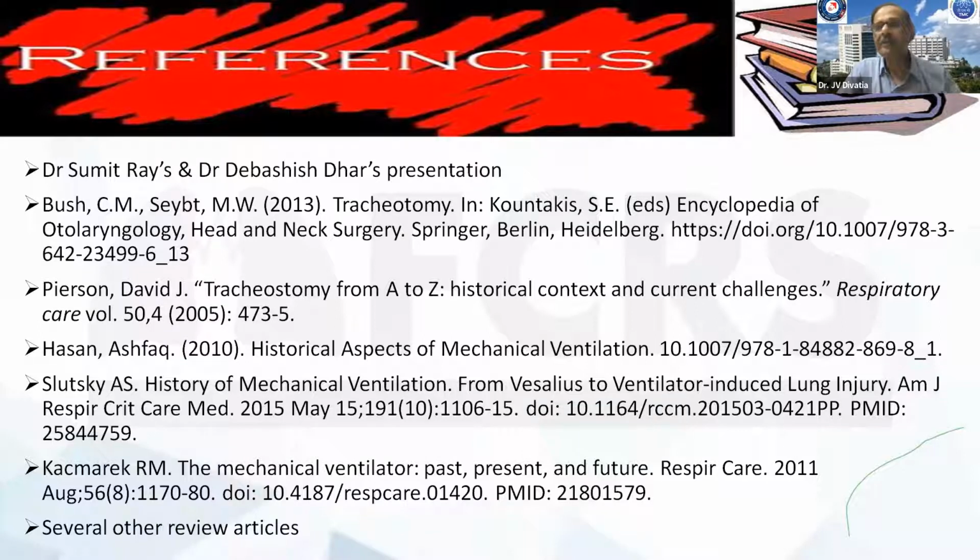development, or the history of the development, of the technology of ventilation, and at the same time the development of the biology of ventilation. I think the first few decades may have been spent in developing the technology, the different types of ventilators, and the switch from negative pressure to positive pressure ventilation, which was a huge paradigm shift that laid the foundations for what we do today in mechanical ventilation. But then the big switch, I think, was the understanding of ventilator-induced lung injury.